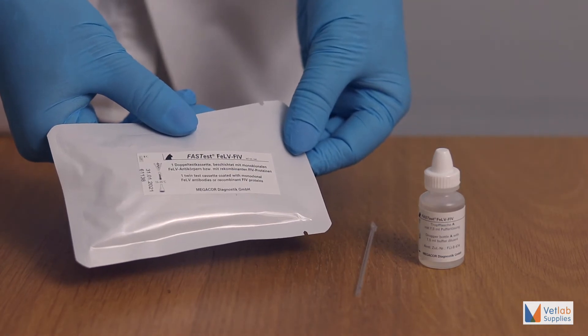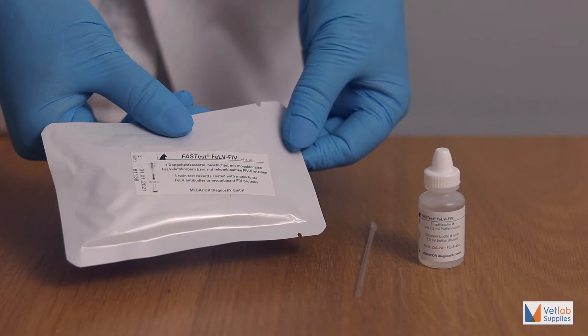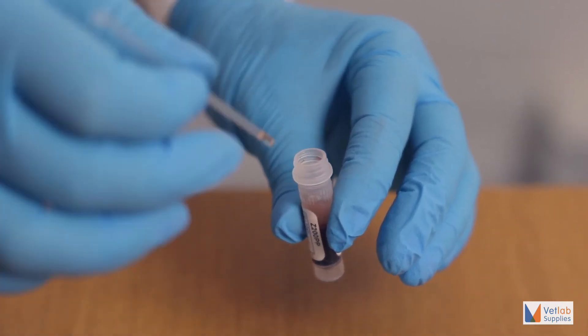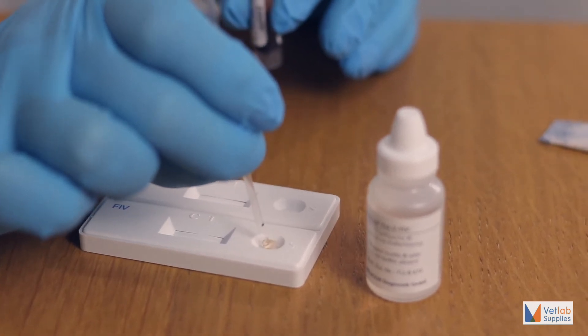FastTest FELV-FIV is based on a rapid immunochromatographic technique. Samples require no special preparation and there are no time-sensitive steps.